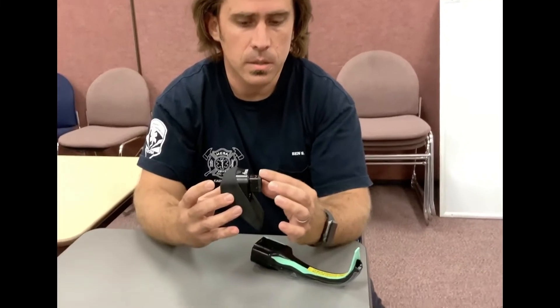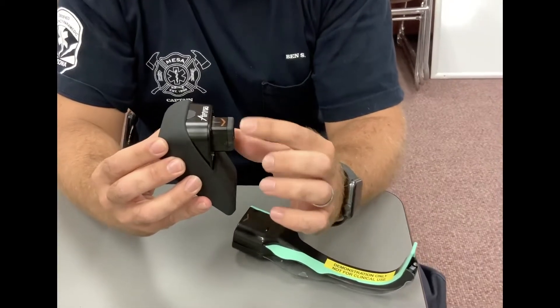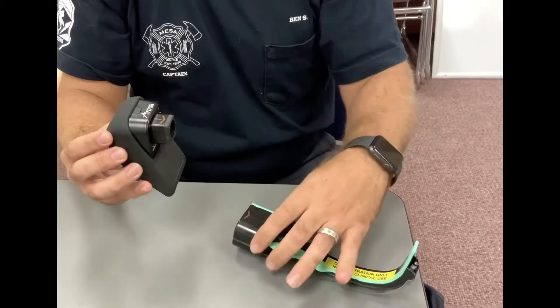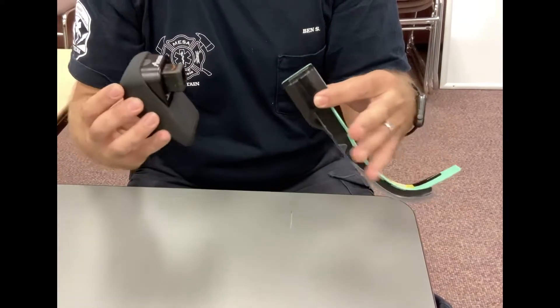Hey everybody, this is Ben from EMS. I'm going to talk about a change we had with our AirTrak cameras. We actually got the new latest and greatest ones that have an update to this gasket. They actually fixed it so that it fits tighter into our blades so it doesn't blade detach as much.